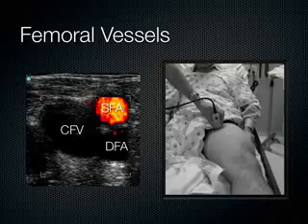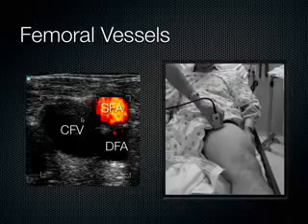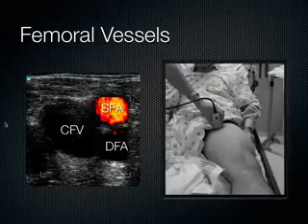Here's the superficial and deep femoral artery. Here's the common femoral vein prior to compression. Therefore, this is the left leg. We aim the indicator to the patient's right. This is medial. The way I remember that the veins are medial to the artery is that venous rhymes with something more medial, penis, venous penis. It's closer to the penis, and that's my way of remembering. I know there's other less vulgar ways to know this, but this, for some reason, always helps me out when I'm on either side of the leg and trying to decide which side I'm on.